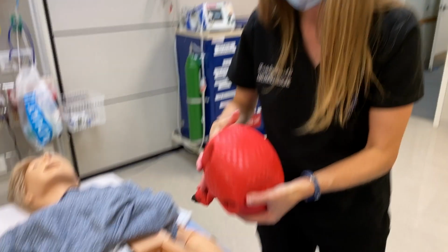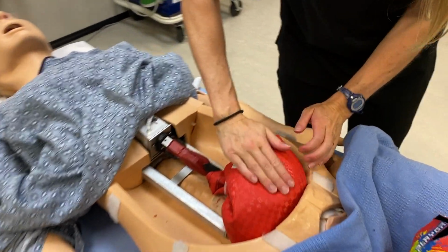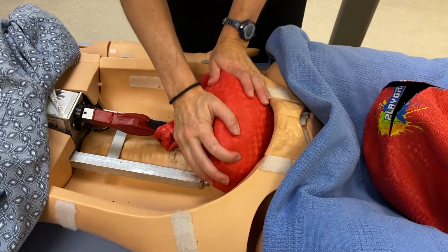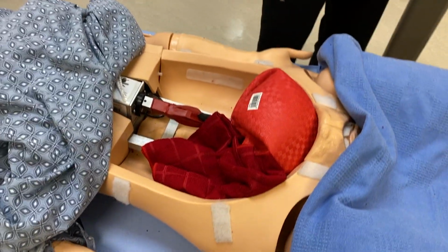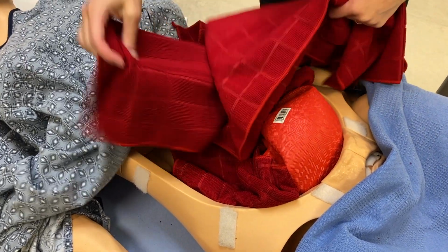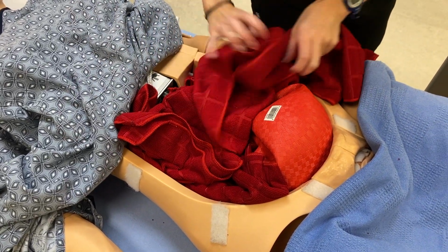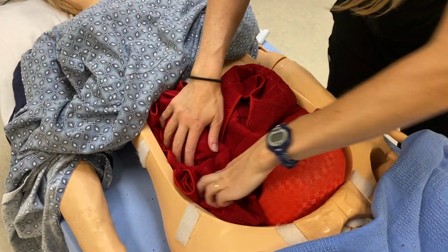Then we'll put it into the mannequin. The balloon, if you tap it, you can feel the balloon right there. And we're gonna move our other one and put our towels in. So the towels just fill up space, yeah? Yeah. Okay. Just space fillers.